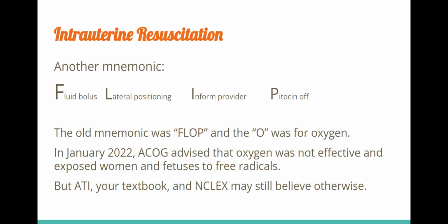Lateral positioning, left lateral, right lateral. The book is always going to say left, but do whatever you need to do to get what you want. Sometimes you don't have to go all the way to hands and knees positioning to enhance blood flow through that placenta. I stands for informed provider. Now, if you're taking notes on paper or if you have a stylus of some kind, you can add a few things. There's a few other things we can do under I. You can do an internal exam to see if maybe what's going on is mom is ready to deliver. You can do an internal electrode to better monitor that baby.